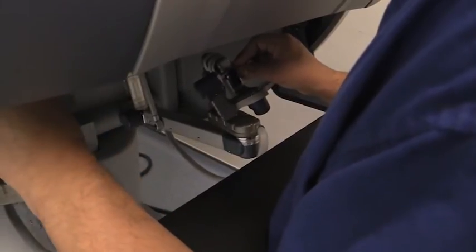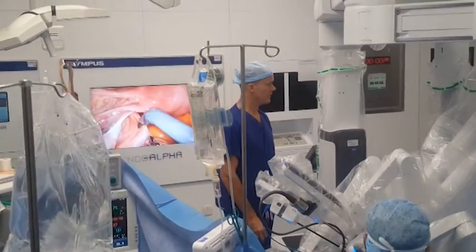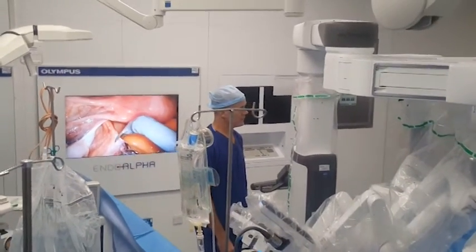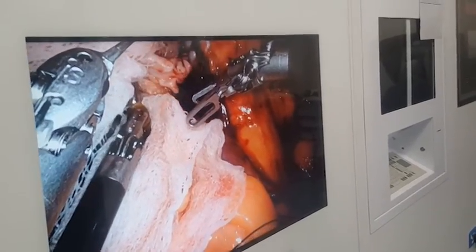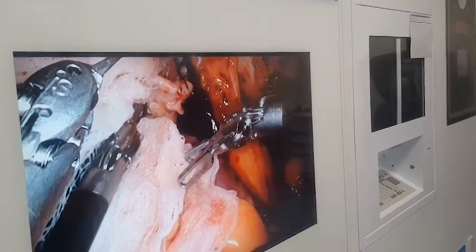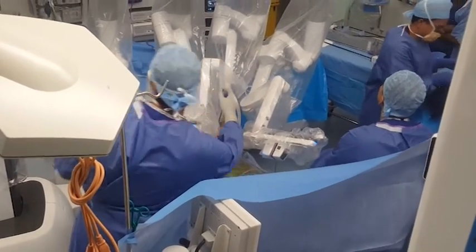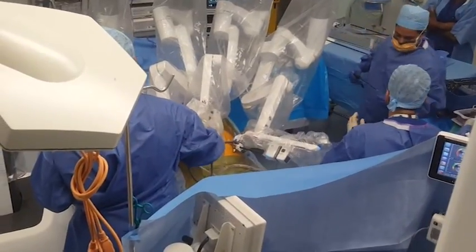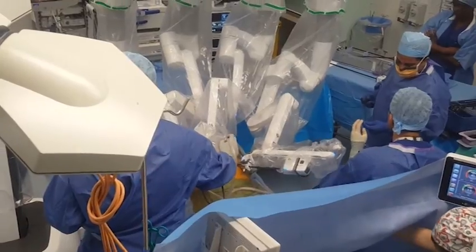So for the surgeon, there are several advantages with the robot. The vision that you get from the robotic camera is unparalleled. It's 3 dimensions, it's high definition. The instruments that we use have wrists, and the wrists have greater range of movement than human wrists do. And obviously you can do the surgery with an extra arm, so it's like having 3 hands inside the patient when you only have 2. So there are several advantages like that. It's a big step forwards.